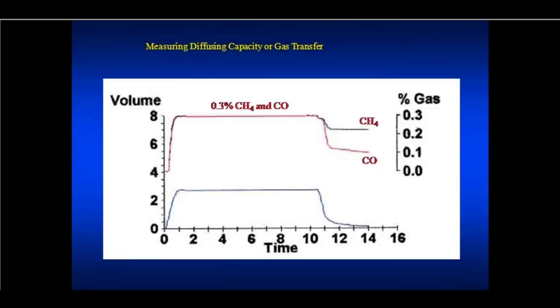All right. So now let's get into how we measure the DLCO. And I think if you understand how we do this with the patient sitting there, it makes a lot more sense when you look at the numbers. So in this test, the patient again is in a chair, nose is pinched, they're breathing in and out of a circuit. They blow all of their air out down to residual volume slowly. It's not a forced maneuver. And then the technician will say, take a deep breath in, and they hit a button.